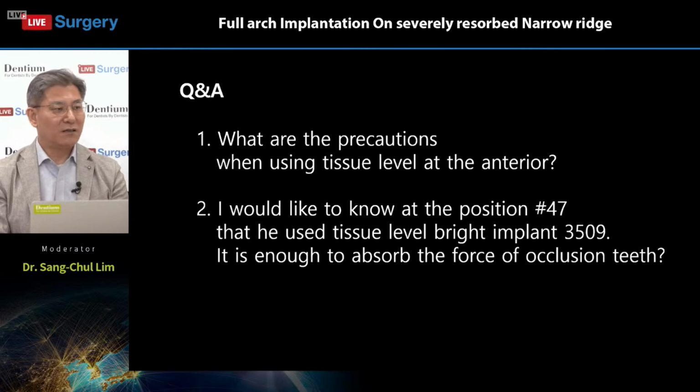Okay, thank you, Guangzhou from China. This is a good question from Guangzhou Yixiang from China. And question number 2: I would like to know, at position number 47, he used a bright tissue level implant, 3.5 diameter, 9 millimeter length. Is it enough to withstand the force of occlusion on the teeth? Yeah, very good question also.